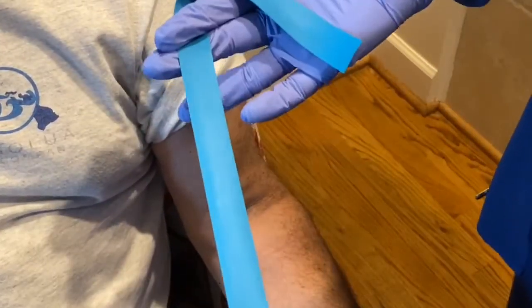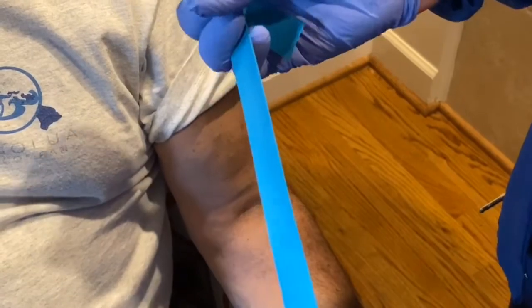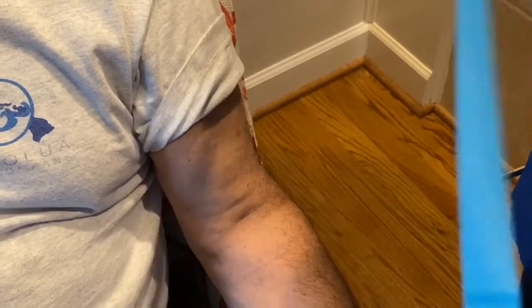I've got my tourniquet, which is a stretchy band. You want to look and check for the integrity, making sure there's no body fluids and everything is okay with the tourniquet. Just FYI, for infection control, these are disposable, so only use them for the patient one time and you can throw them away.